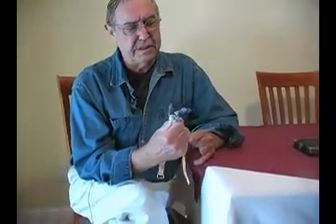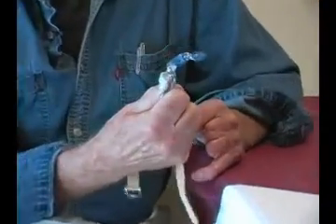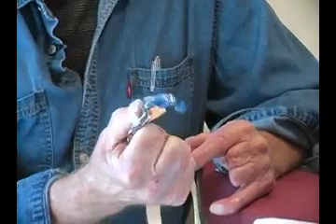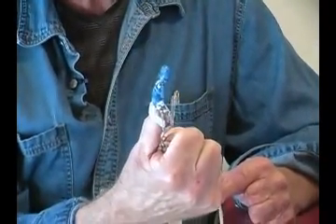Most prostheses in the fingers are what they call passive devices. These will become what's known as an active device — by that I mean you are the function, and they will be activated by the residual portion of the finger that you have left after an amputation.